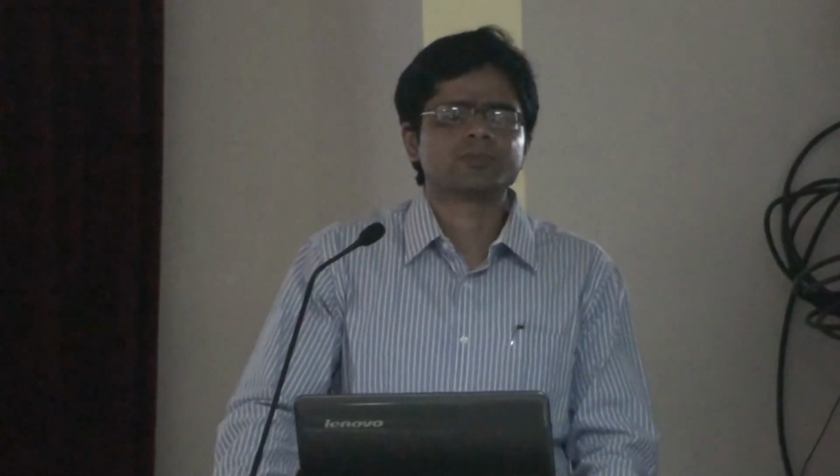But I would like to give you one word of caution, because it will amount to criminal negligence if we cannot do ABG while administering non-invasive ventilation. Yes, always. So one should keep that in mind. If you do not have adequate backup of ABG, because ABG is so vital in these cases, you do not know what is happening inside that particular patient. Every 2 hourly or 4 hourly you must do an ABG to see whether pH is decreasing, whether PCO2 is increasing, or PO2 is adequately increasing or not. All these parameters you must see serially. Otherwise, it is almost amounting to criminal negligence if you cannot do that. So that word of caution everybody should keep in mind.